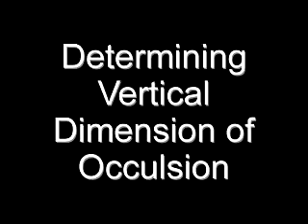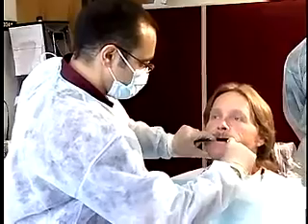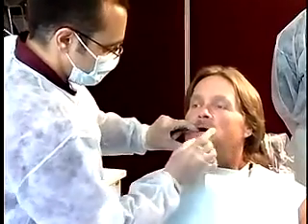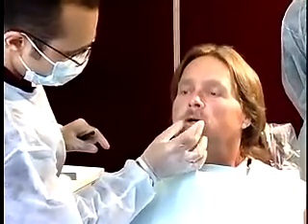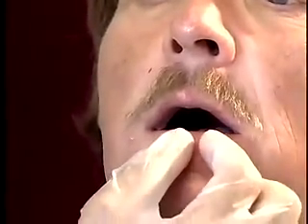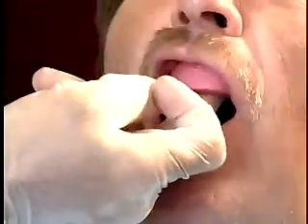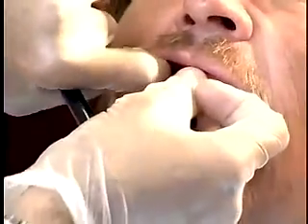Place the mandibular record base in the patient mouth and evaluate the position of the occlusal plane and do all necessary adjustment for the mandibular wax rim. Then check both maxillary and mandibular wax rims in the patient mouth.